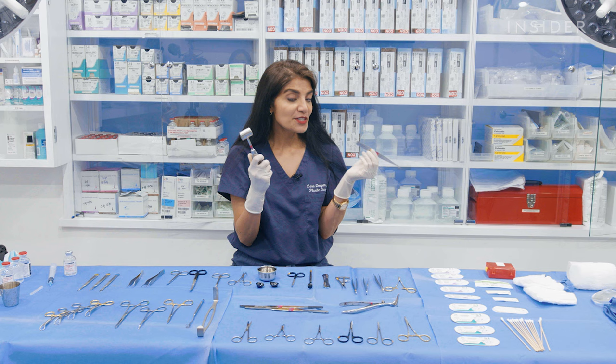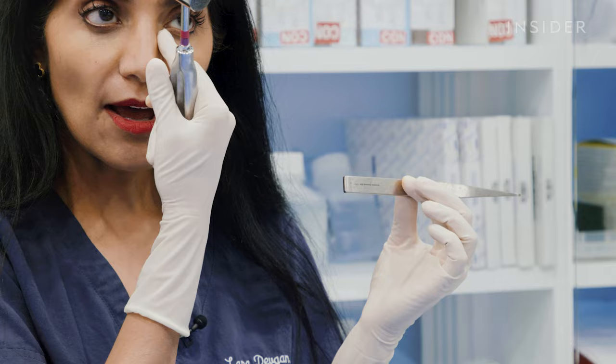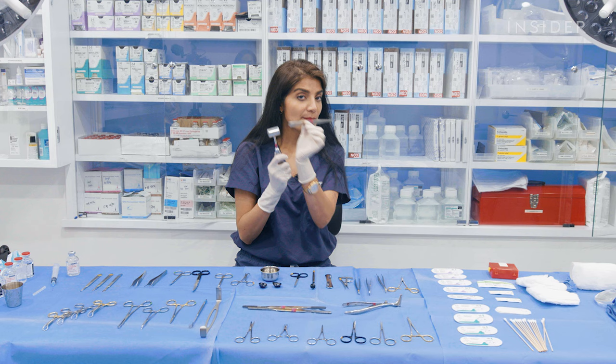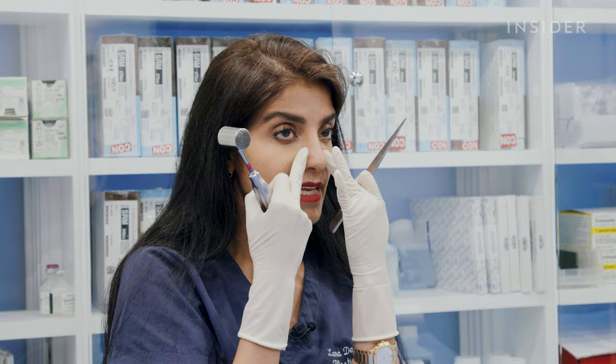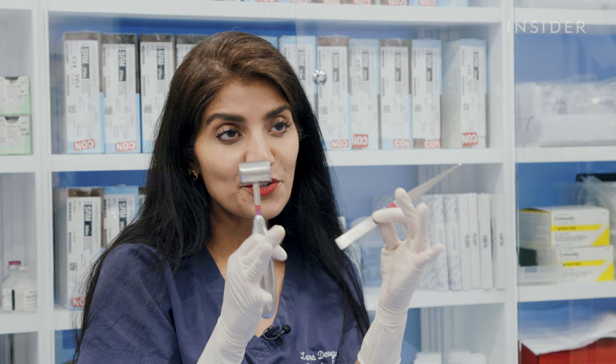So in order to create controlled breaks of the nasal bones, I actually create postage stamp little breaks along the sidewalls of the nasal bones using the mallet and osteotome. And we do that just like that. Tap, tap, tap, tap, tap, tap, tap, tap. By making little osteotomies all the way down the nasal bones on both sides and infracturing the nasal bones. So this is a very interesting and unique instrument. It looks a little barbaric, but it's actually incredibly controlled in precise hands with very controlled, precise movements.